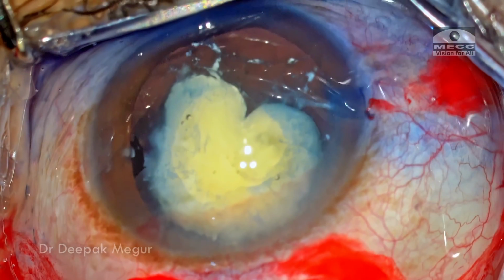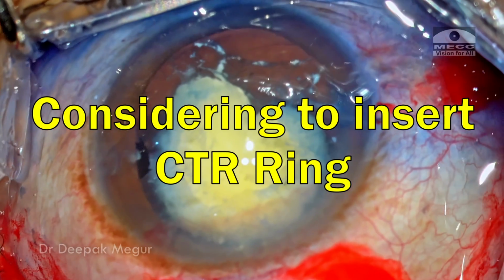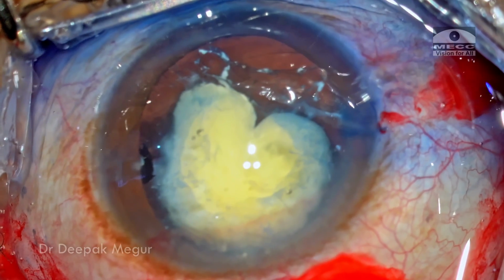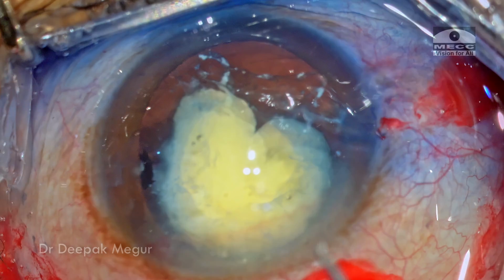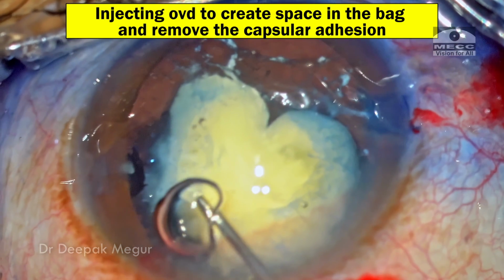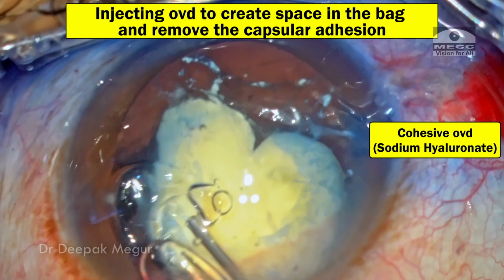Now is the time to consider implanting a CTR, but before that I need to create space within the bag, because the bag is shriveled and the posterior capsule and anterior capsule are adherent to each other in the majority of the areas, and also the posterior capsule would be sticking onto the undersurface of the nucleus. So I need to create space and I'm going to inject cohesive OVD specifically for this, that is sodium hyaluronate.